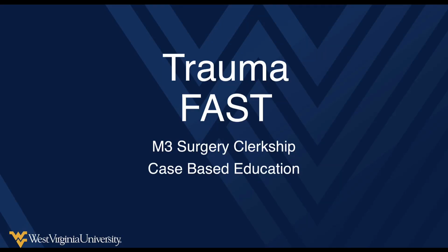Hello everyone, and welcome to this session on point-of-care ultrasound and trauma, primarily focused on the FAST exam, again targeted primarily at our third-year surgery clerkship students, but may be relevant in multiple other scenarios or any place where you may deal with patients with trauma. We're going to quickly review the normal findings and how to do the FAST exam, and then we're going to jump right into some examples of abnormal findings and then try to talk a little bit about how to integrate this clinically when you're caring for patients.